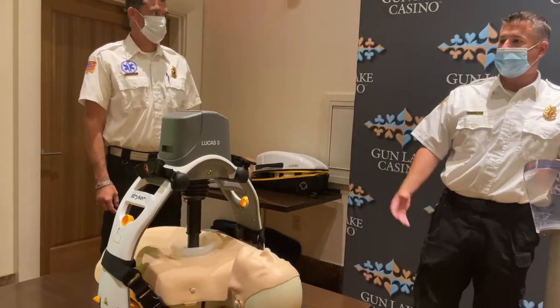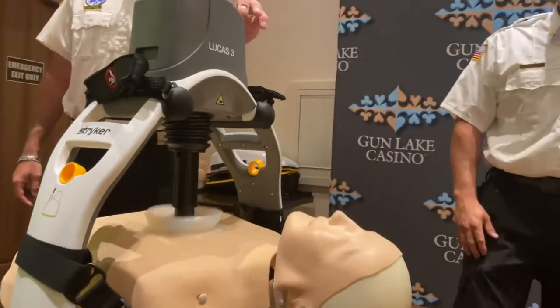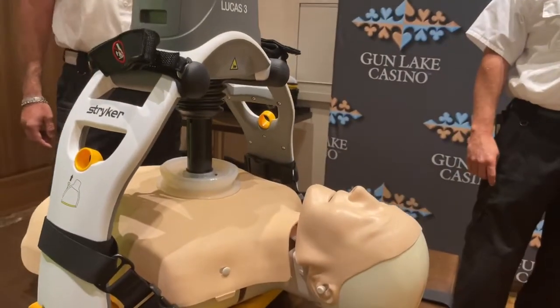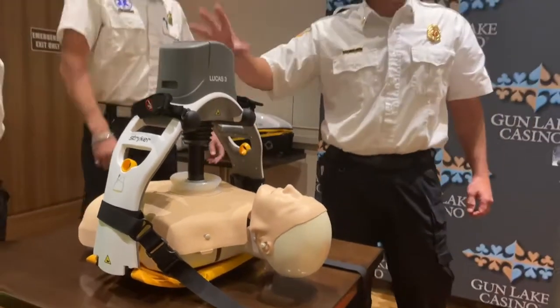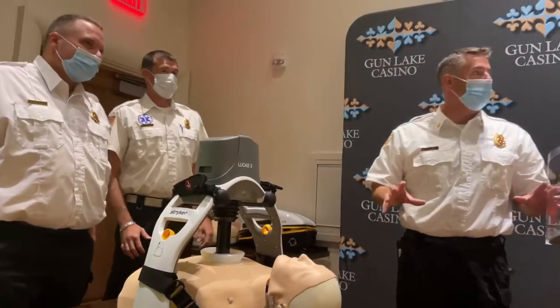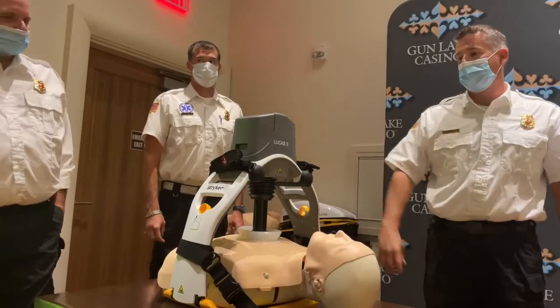It comes with two batteries, and each battery will go for 45 minutes. So you can pause it, swap it out. It remembers for up to a full minute where it's at — the depth of the person, everything — so you can swap it out and go right back to where you were.